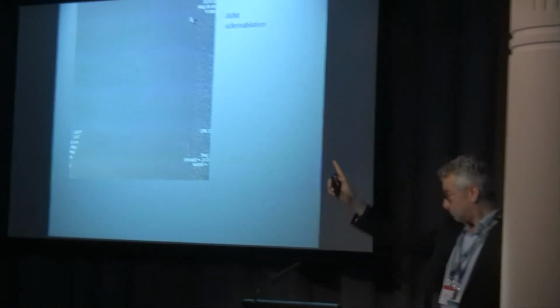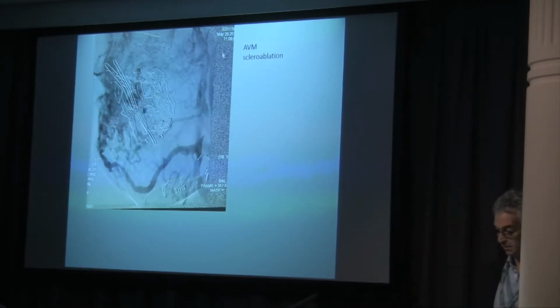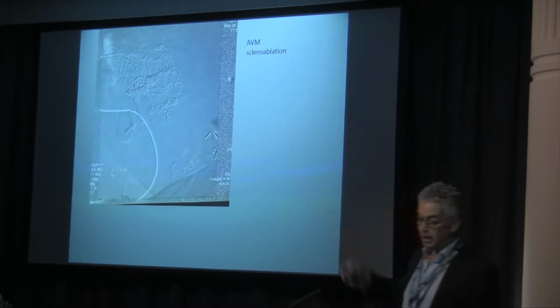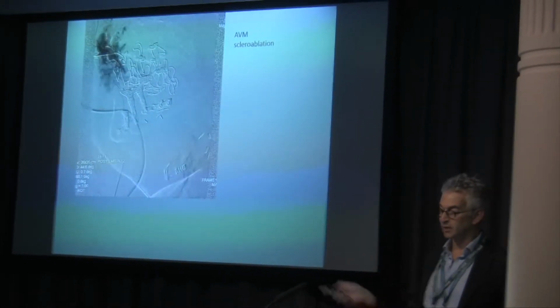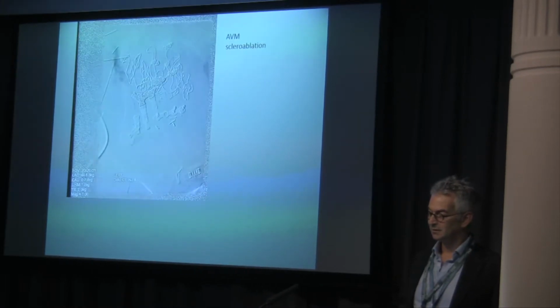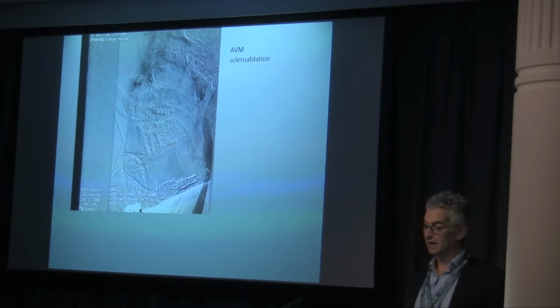Arteriovenous malformation's got a mention, if you could play that one. This is by way of using it to inject into a very troublesome cancer type. I know they're not an official cancer, but they certainly behave like it. This is somebody's face, this massive arteriovenous fistulation, and then you can see we're injecting alcohol, trying to find the arteriovenous nidus, the transformation. Just give me a couple more moments. You see it's still flowing, flowing, flowing. It's all a bit sped up, obviously it takes all afternoon. There we go, and now it's gone.